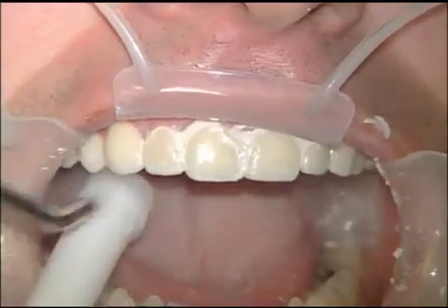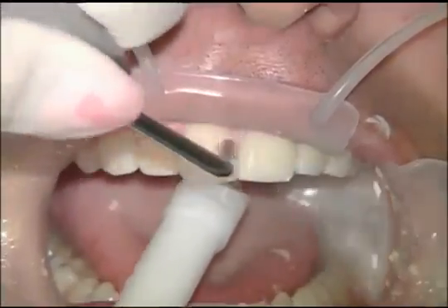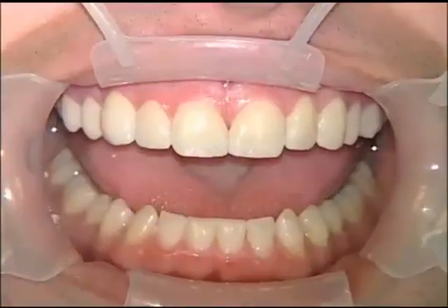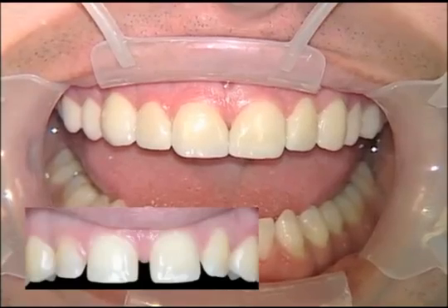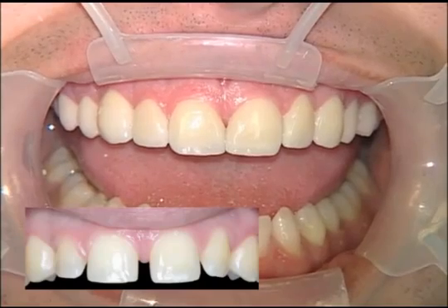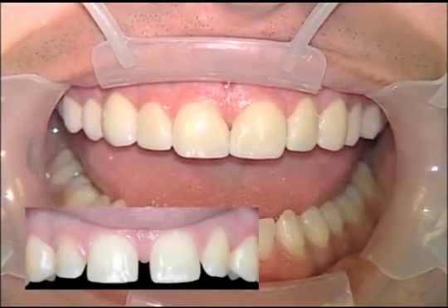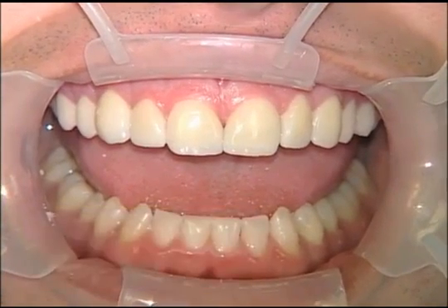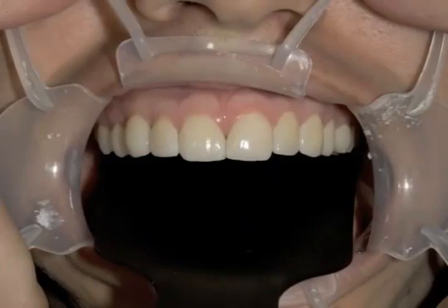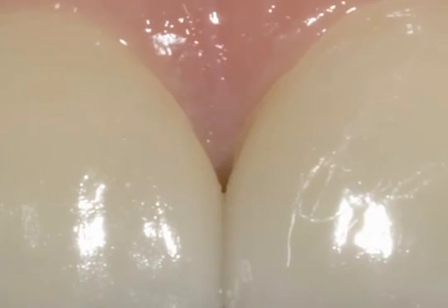When we're done polishing, we're going to rinse off the rest of the polish from the veneers and take a look and see how they look and see if we've got anything that needs to be touched up. You can see on the before picture the big spaces that were present before. This is one of the great times to use a no-prep case when you've got somebody who needs a little additional tooth length and has some large diastemas between their teeth, because you can accomplish both those goals at the same time. You notice we still have a small black triangle at the gingival margin between 8 and 9 in that gingival embrasure. Sometimes with a no-prep case, it's impossible to close a large diastema completely. In fact, that's a really good job that the technician did on this case.